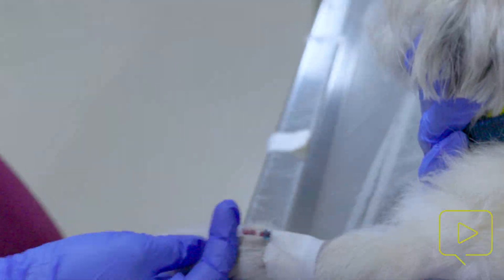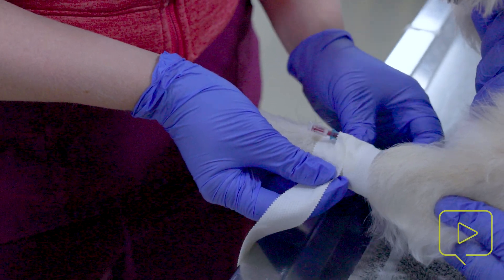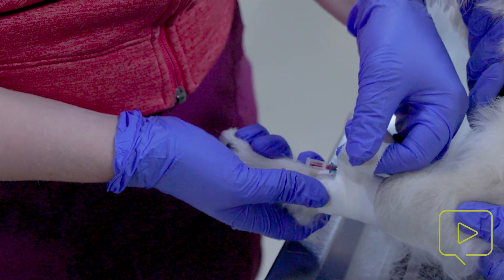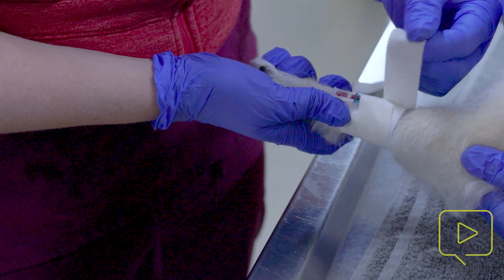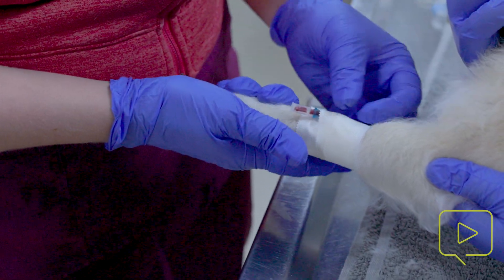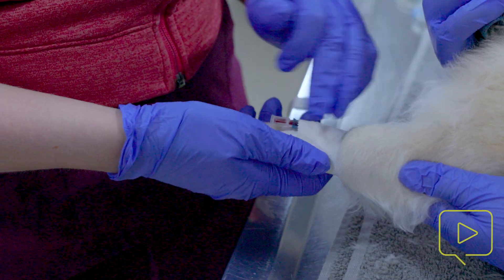The second piece I personally call a bra strap piece because it supports the first piece of tape. You're going to wedge it underneath, sticky side down, up to that first piece of tape, and then wrap it around — pull it taut on the bottom and lay it gently over the top. I don't want to cover right here because I'm going to put a T port on there. The reason why we wrap up the leg is because if you stack it all on top of each other, it's going to do what we call braceleting and just slide right off the leg — especially for dogs like Shih Tzus and Bulldogs who have thicker legs up top and smaller ones below. So we want to give it extra surface to stick.